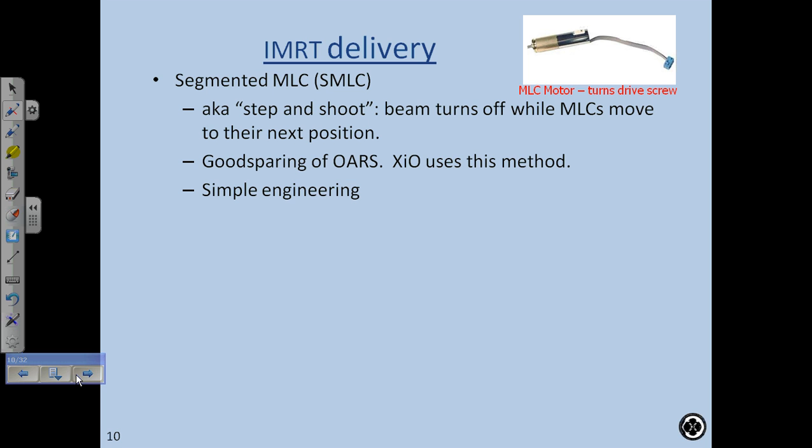The other thing to remember about step and shoot is that dose rate is constant. Okay, so you can run it at a high dose rate when the beam is on. So after the MLCs have gotten into place, the beam can be on at the highest dose rate.